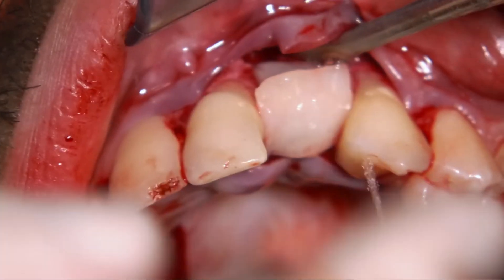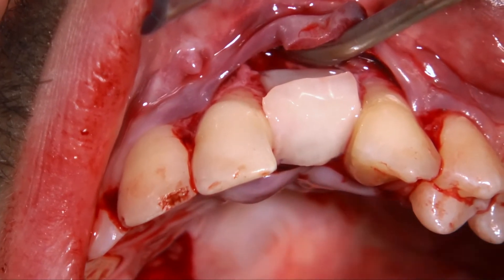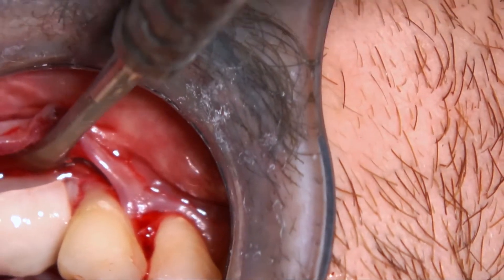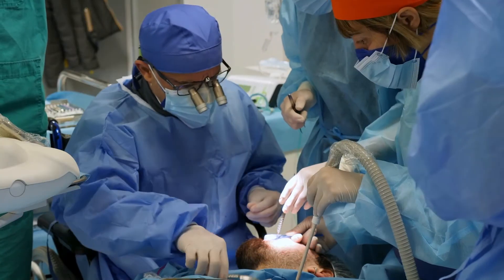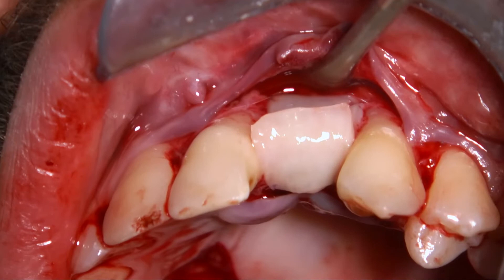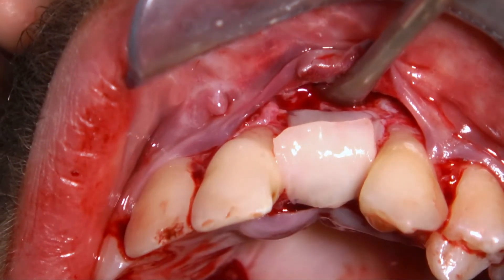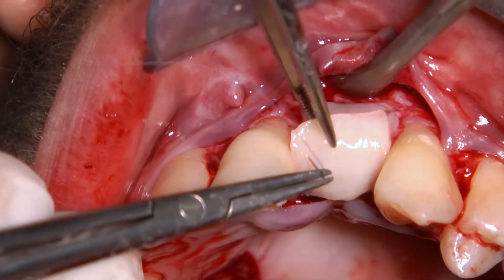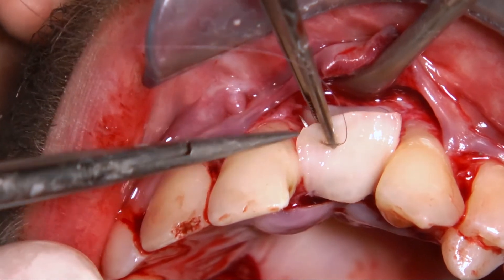Now I have to try to stretch this graft by connecting it at the buccal aspect, because it's very important that this graft is mainly positioned so the palatal anchor is only there to give the possibility to stretch the graft.